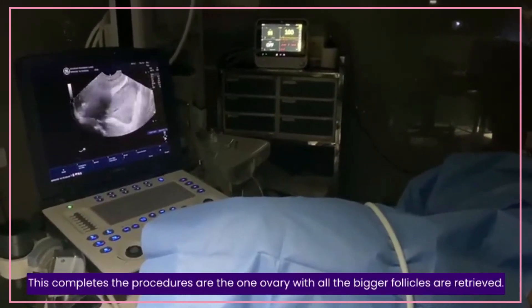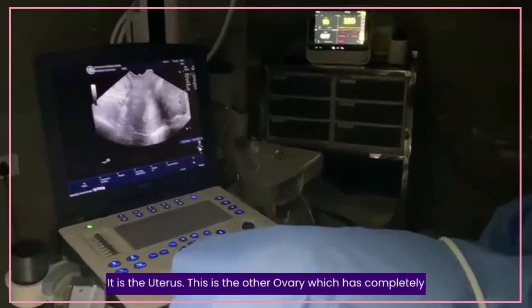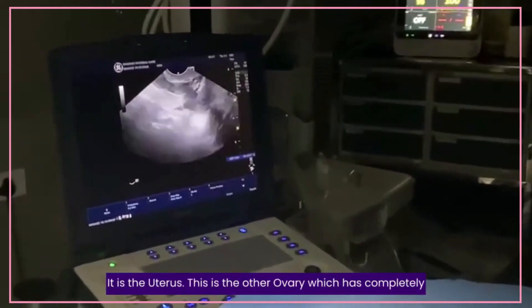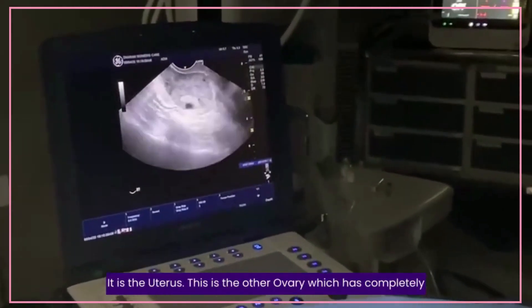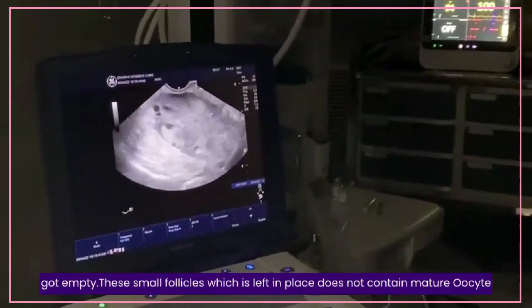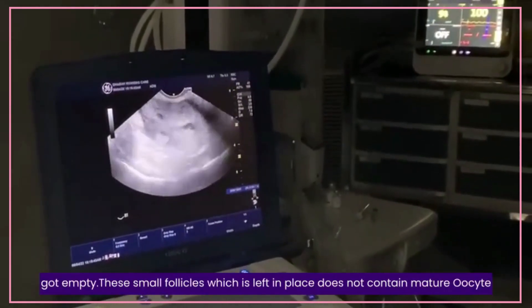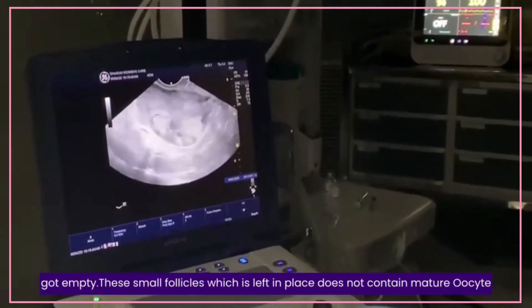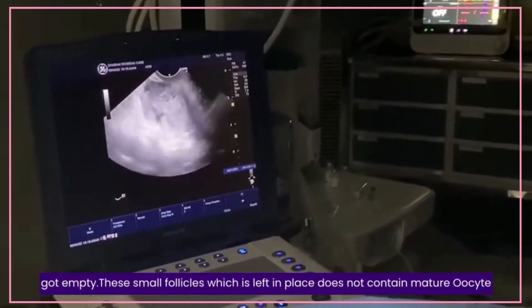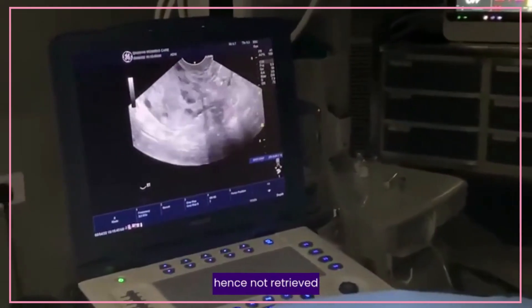One ovary with all the bigger follicles aspirated. Here is the uterus, and this is the other ovary, which has completely emptied. These small follicles which are left in place do not contain mature oocytes, and hence are not retrieved.